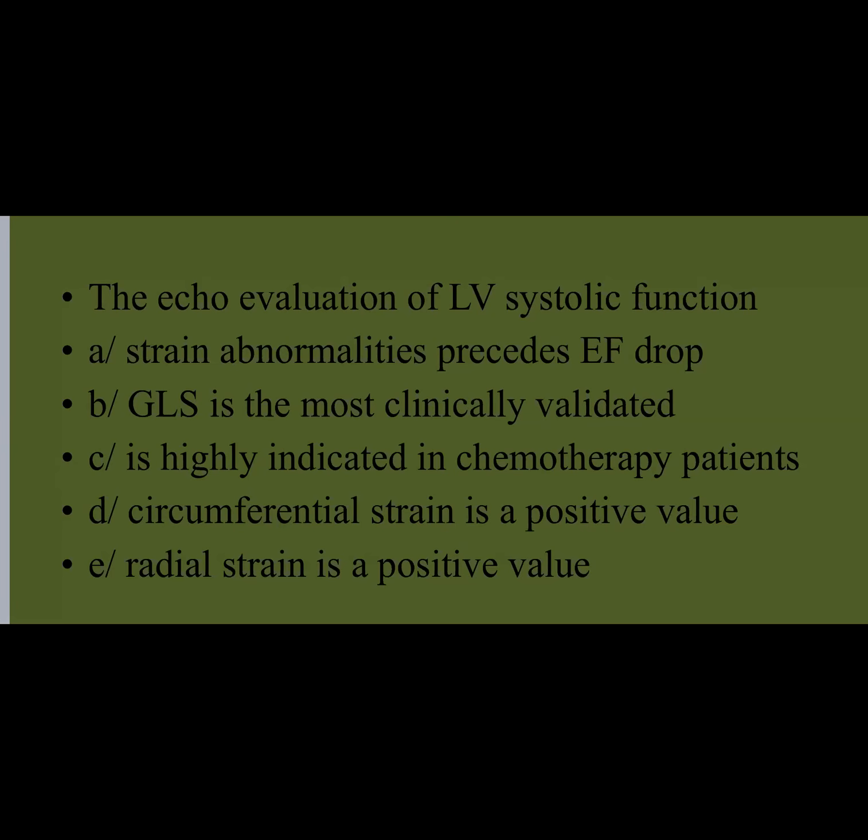Any guess? I think it is possible. Highly indicated in chemotherapy patients, okay? I'll go with A. B. A, A. D. B. C. A, B, and D, and C. So again, I have the scatter, which makes me happy to discuss this one later, and you will come to the right answer. Good.